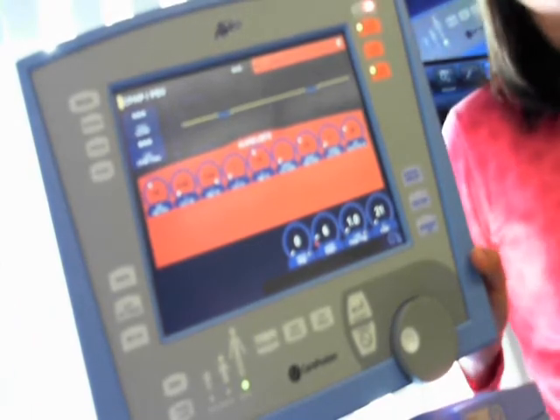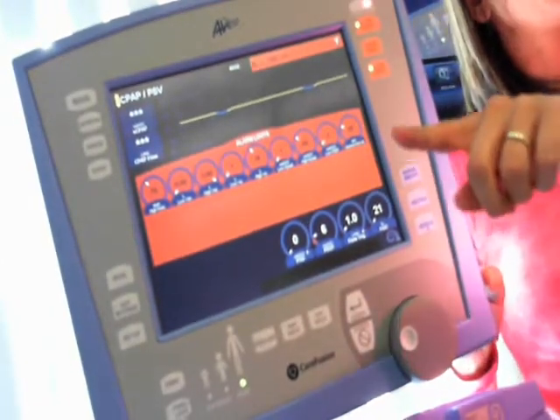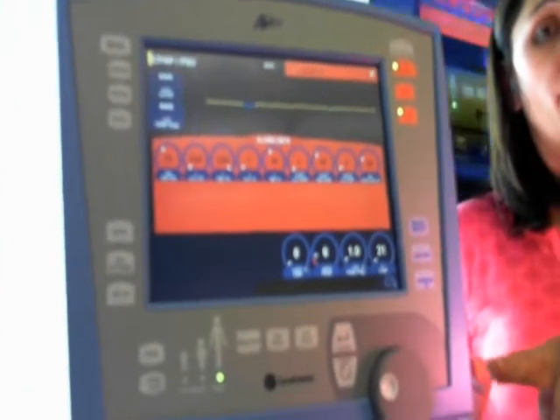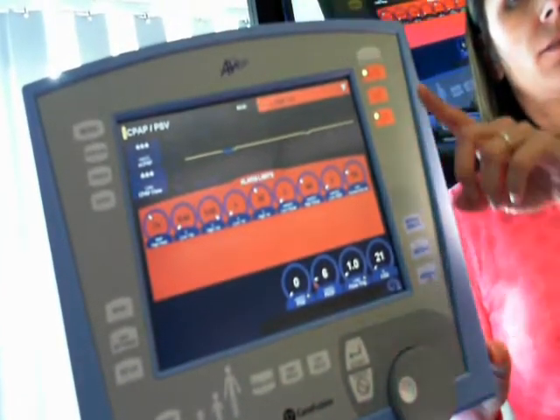And it's really not complex as to how we're going to find the leak. We always start at the level closest to the patient. And to demonstrate this, Marsha, I'm going to have your camera move.